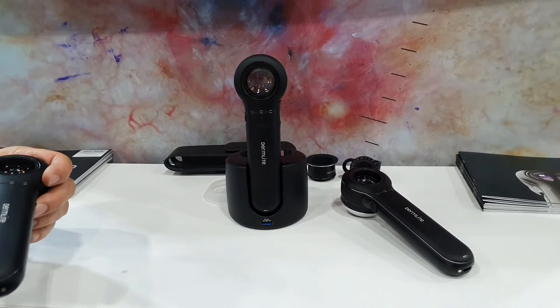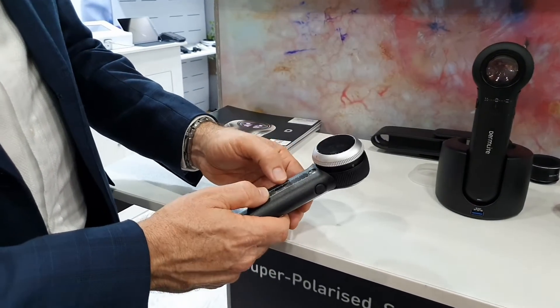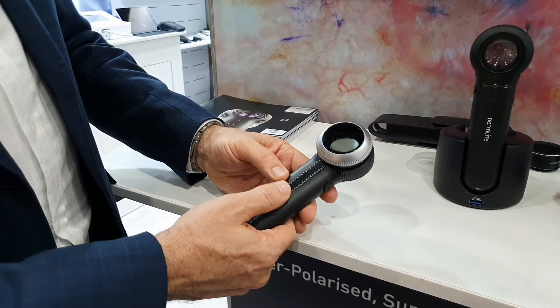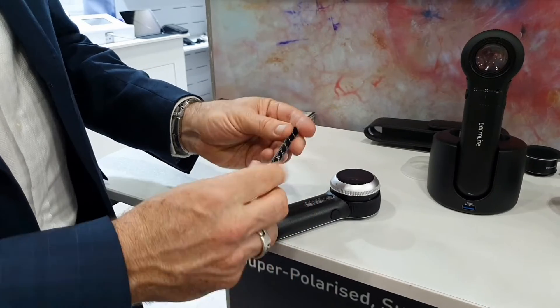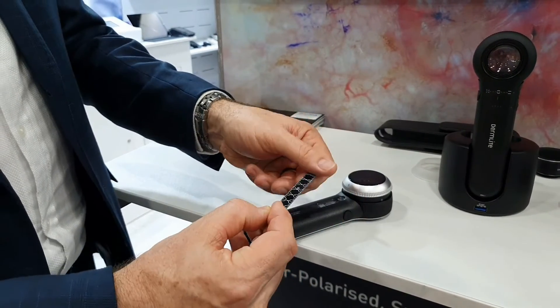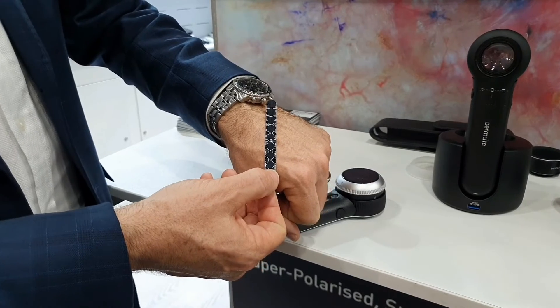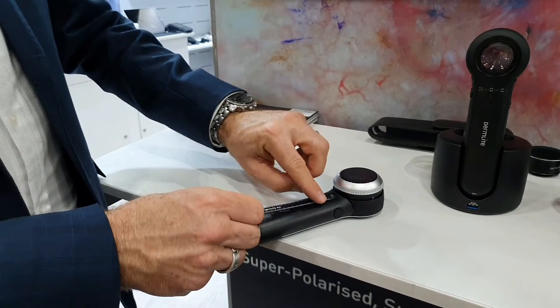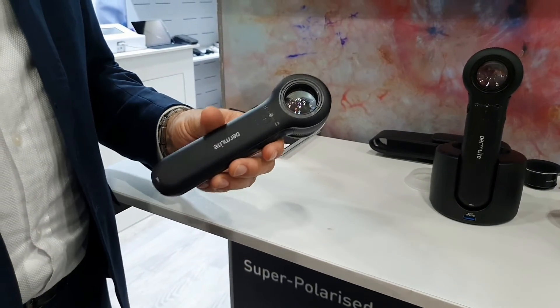Finally, on the back where we've got the LED torch mode, there's a magnetic ruler. Press in the middle, slide it up a bit, and it pops off — giving you a measuring ruler on the back. It also has some little circular measurements if you want to measure the size of a biopsy punch. You can then snap it back on the side, and there you go.